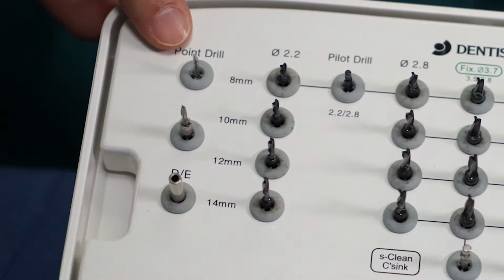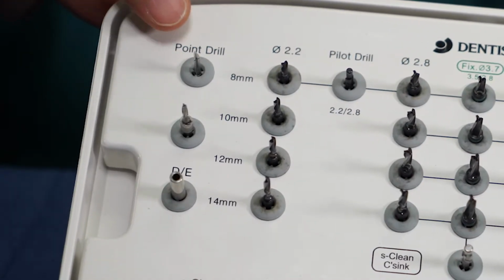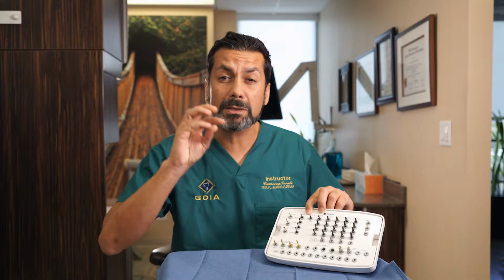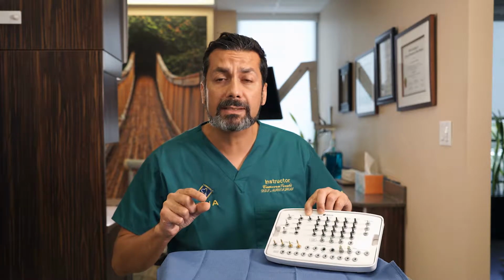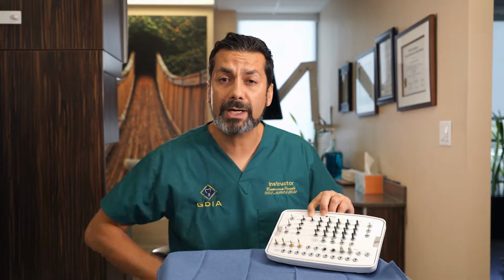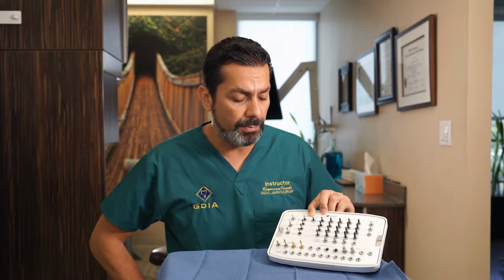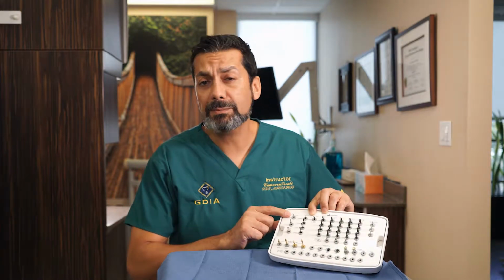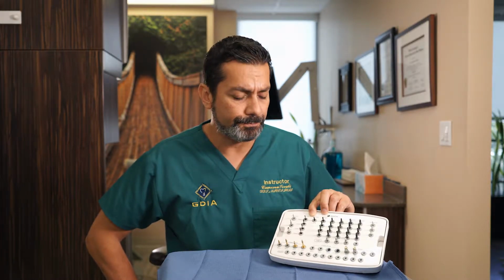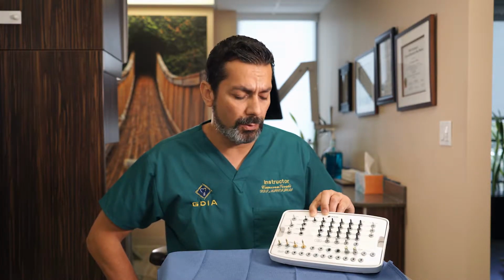Up on top over here, it says point drill. That's your lance drill. That's usually a drill that you use to start your osteotomy, just to make a little indentation in the cortex so that your actual twist drill does not bounce around when you're trying to get into the bone. That is usually something good to use, especially in the lower mandible, in the D2 bone.